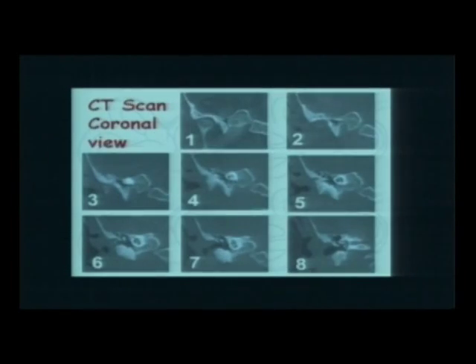Really, something which is really nice is that underneath the cochlea is the carotid. And then coming from behind, you will find that this is the carotid. Coming from behind and lateral is the jugular. And after a certain point, it only becomes the jugular. And at the jugular here, there's a thin plate of bone. You can look through the middle ear. If you adjust your microscope and remove part of this bone like that, you can see the jugular plate of bone, which looks bluish in color.